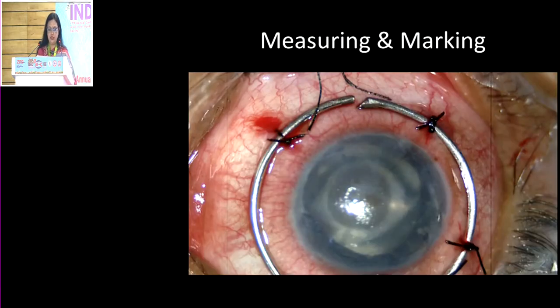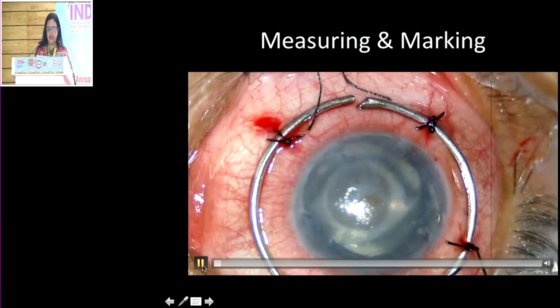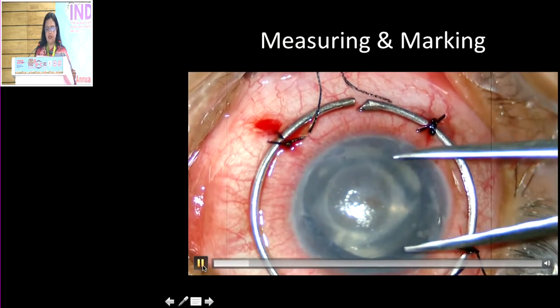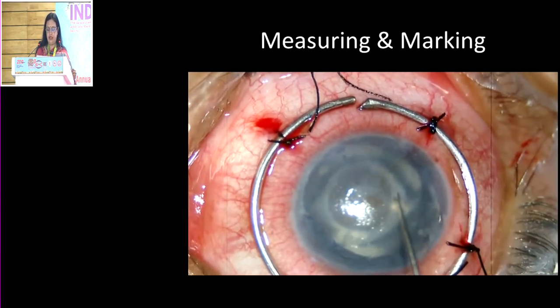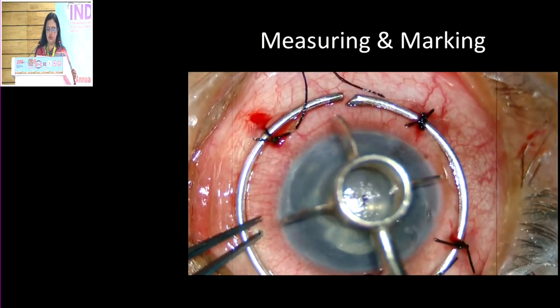The next step is how to measure — deciding what size trephine to use. It's important that you measure the cornea. If you're planning on somewhere between 7.5 to 8 millimetres, you mark and see whether you can accommodate it, ensuring you have at least 2-3 millimetres of corneal rim left behind so that it is not too close to the limbus.